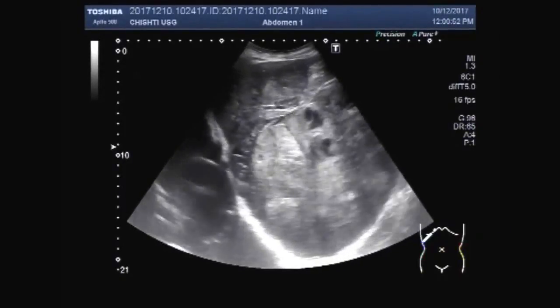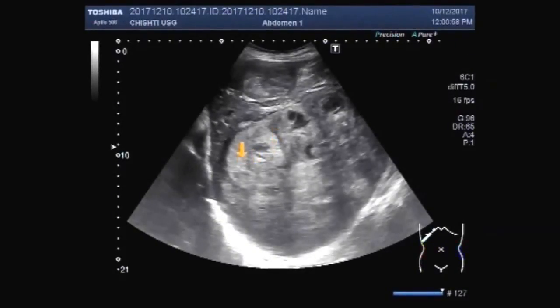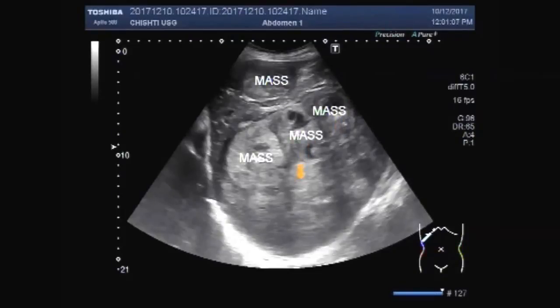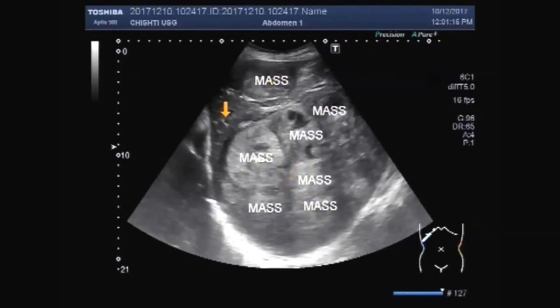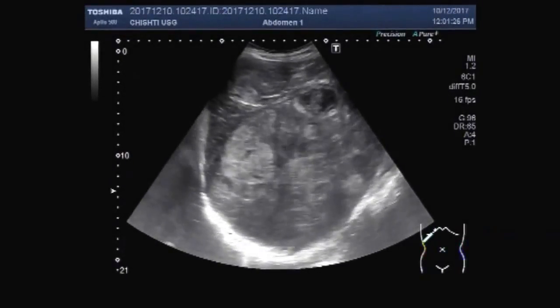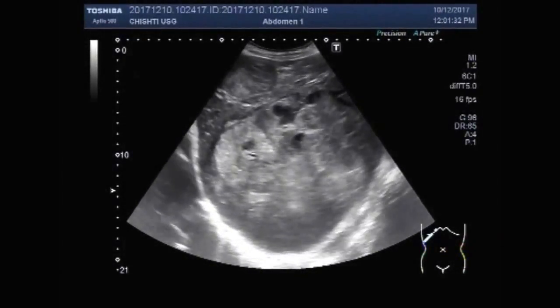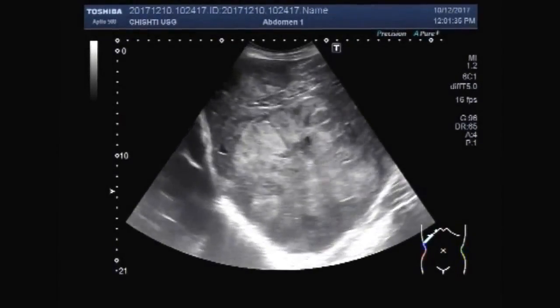This ultrasound video shows multiple masses in the hepatic parenchyma. You can see these multiple masses. Nearly the whole of the hepatic parenchyma is involved. You can see these semi-solid to solid masses.